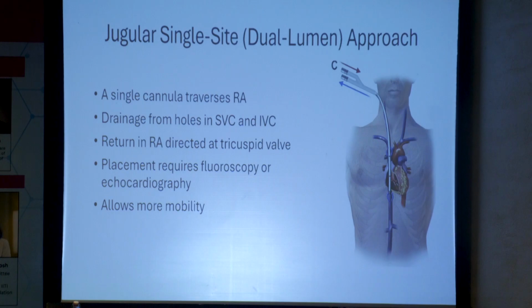Yes? I just got one question. Why can't we place the same dual-lumen cannula through the femoral approach? You, in theory, could. It would have to be a very long cannula, and I don't know if those are commercially made. So then the whole idea behind this, Raj is going to tell you, is what is the big advantage of the neck?